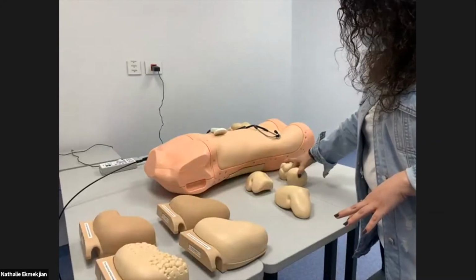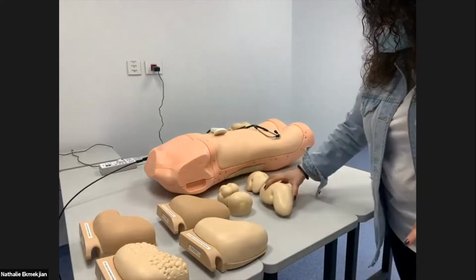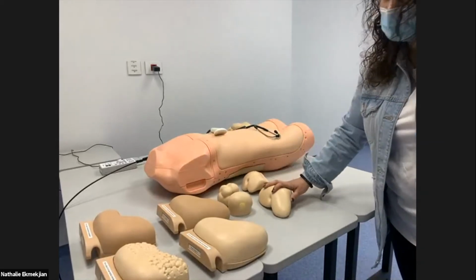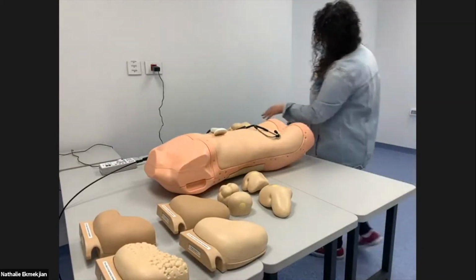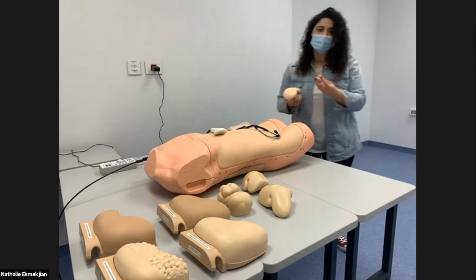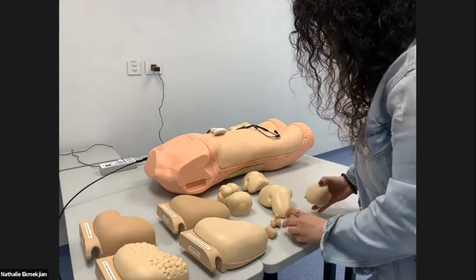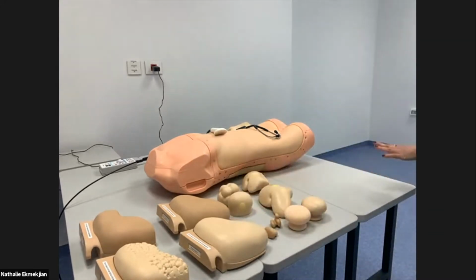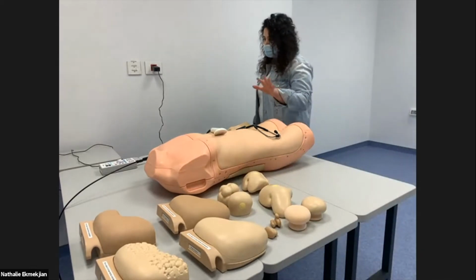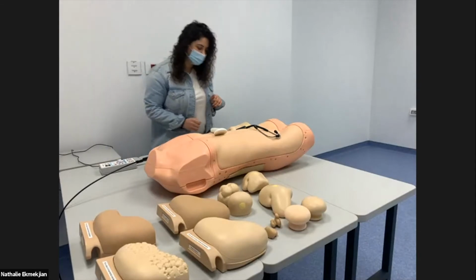We have for the kidney, normal, cyst, and hydronephrosis. For the spleen, we have the normal, slightly enlarged, and enlarged. For the uterus, we have the normal and fibroid. And for the inguinal lymph nodes, we have the normal and lymphoma. This part is for the palpation, and the controller is used for the auscultation.